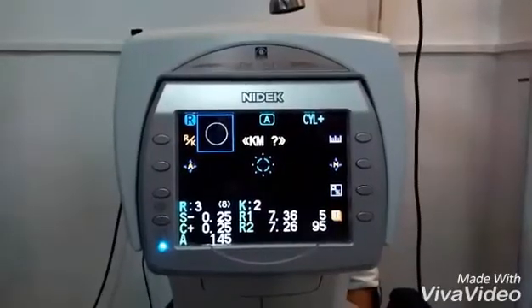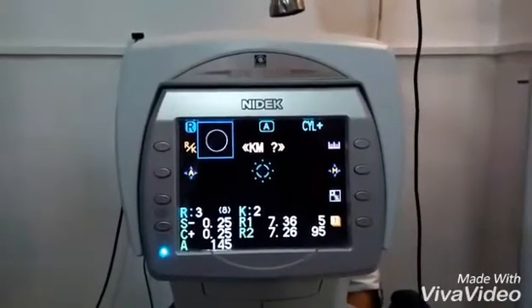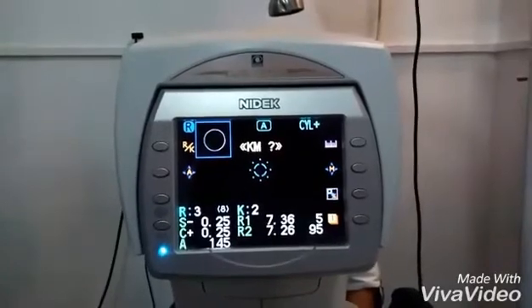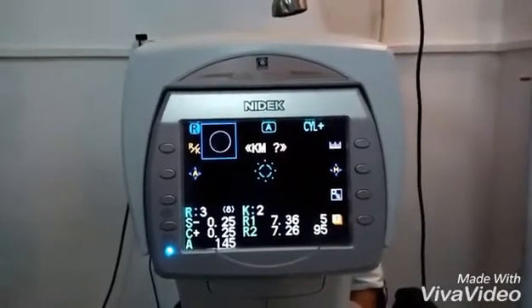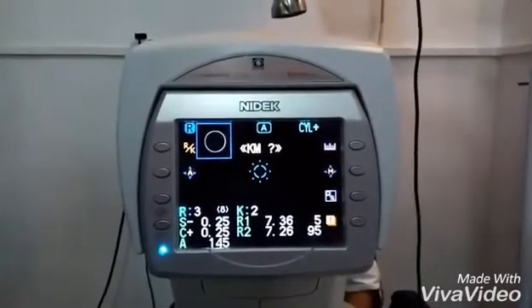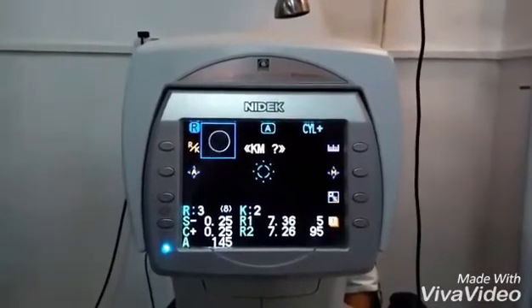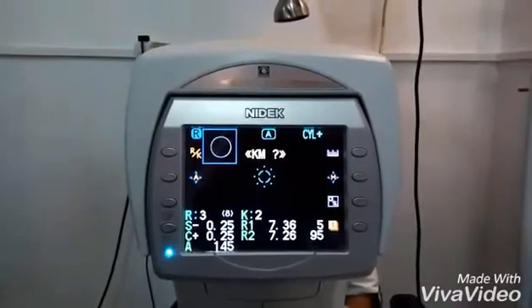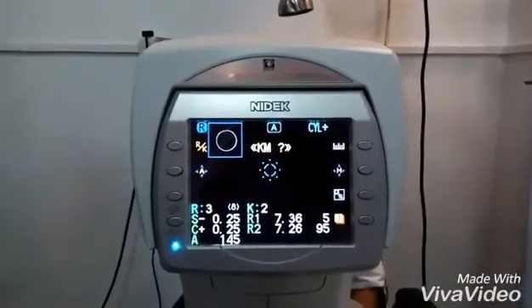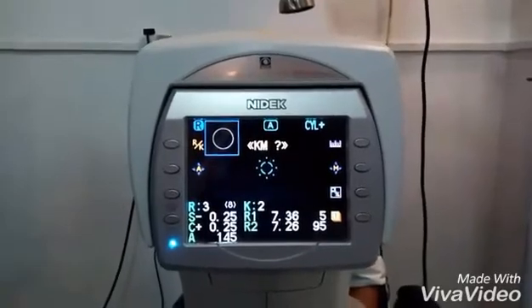Now that the reading has appeared, the interpretation of the readings are as follows: R is the number of readings; S is the spherical power reading; C is the cylindrical power reading; A is for the axis; K is for the keratometer reading; R1 is the horizontal meridian; R2 is the vertical meridian. In some other refractometers, PD will also be shown, which stands for the pupillary distance.